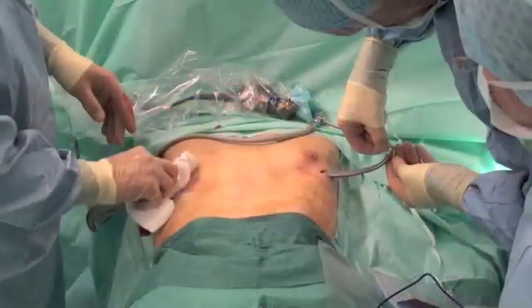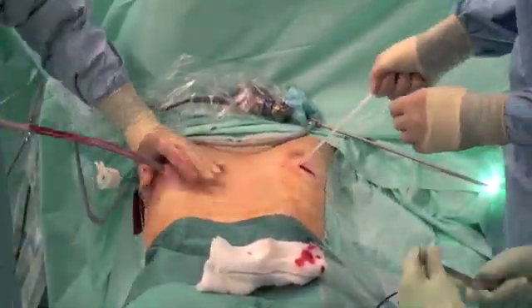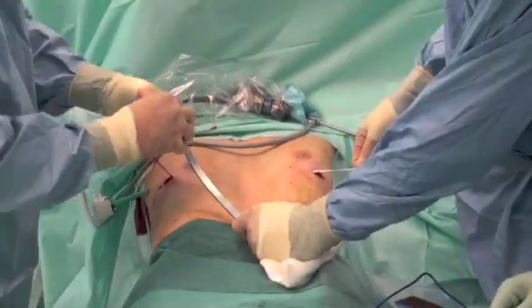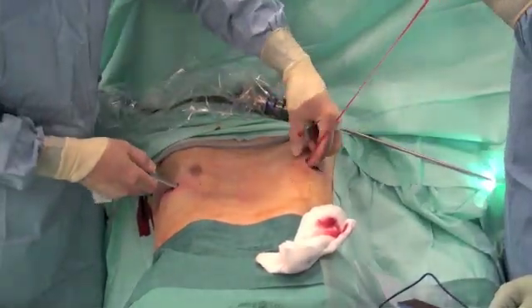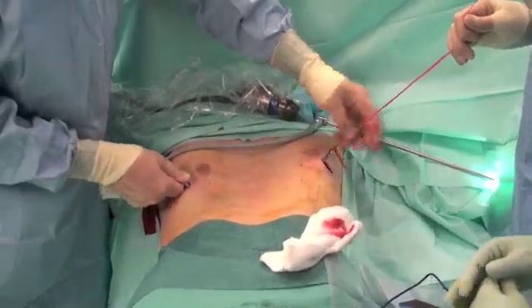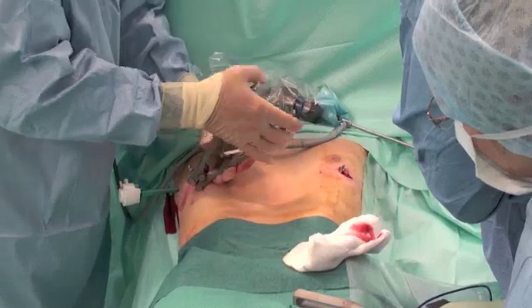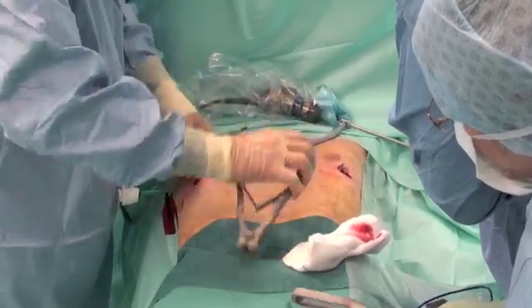This is an important part which moulds the chest. Then a tape is just brought through. The pre-bent bar — this is the implant — is placed in the chest, obviously put in upside down. Then using a device, we just bend this a little bit to get the bend perfect. It is easier to do this before it is flipped.